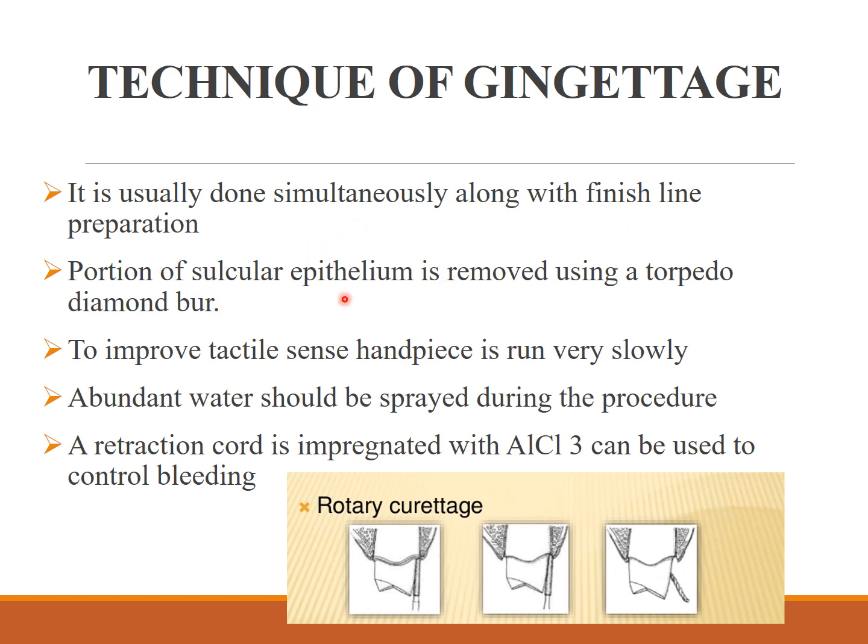A portion of the sulcular epithelium is removed using a torpedo diamond bur, which improves the tactile sense, running very slowly.